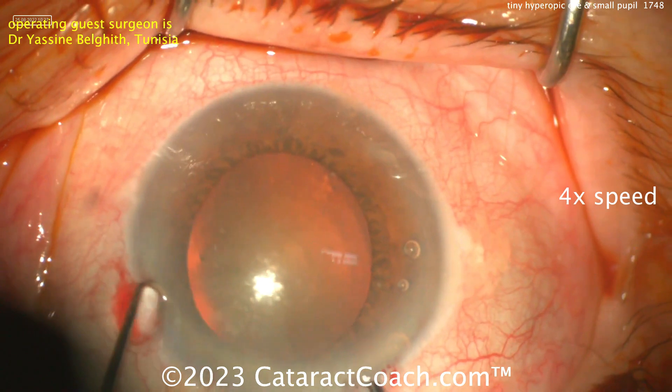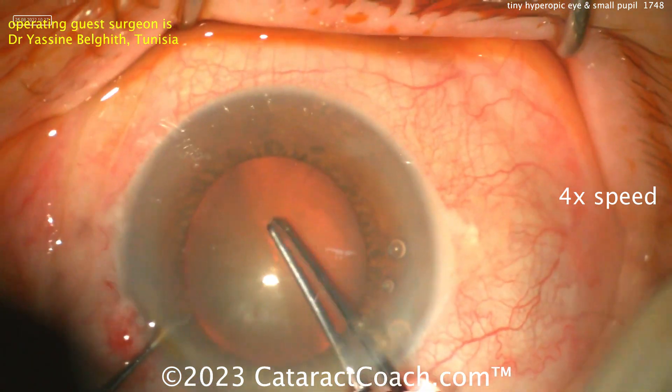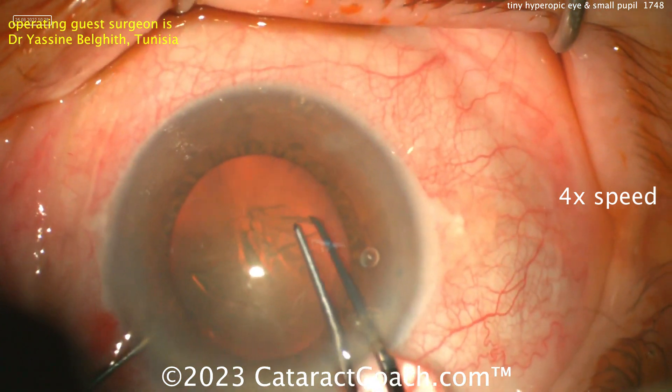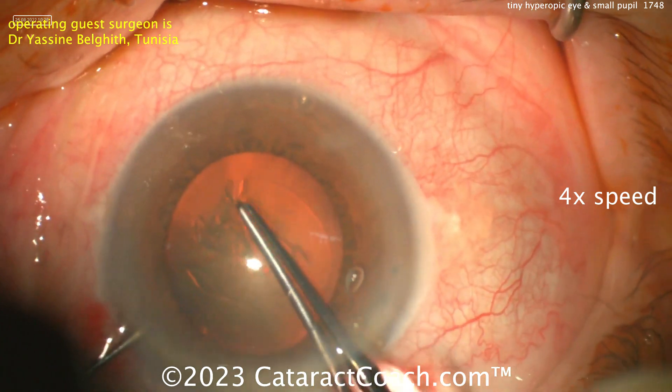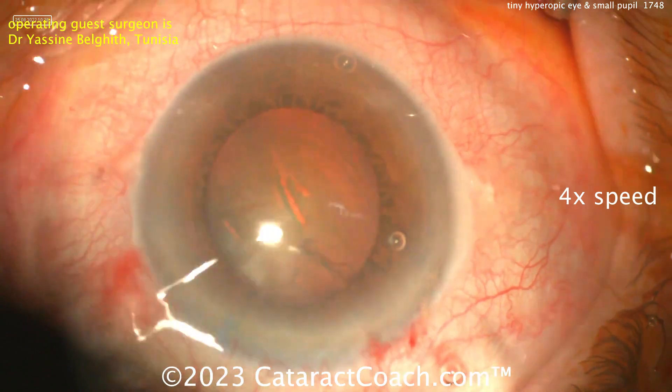This is a tough case because this pupil is going to come down and be a lot smaller. Now measuring out that capsulorhexis — don't make a tiny capsulorhexis, because remember this pupil is much smaller than you think. It looks big, but it's probably at best a five millimeter pupil. There's a good capsulorhexis, nicely intact.